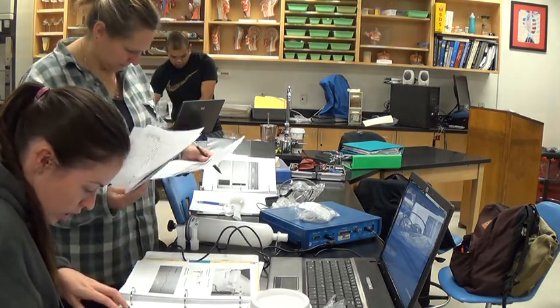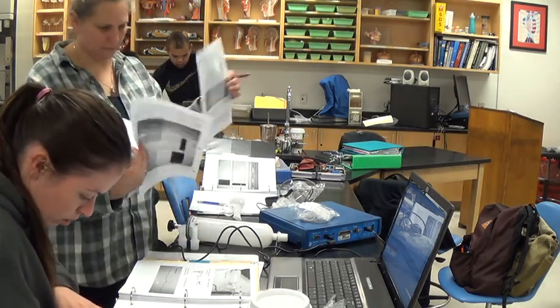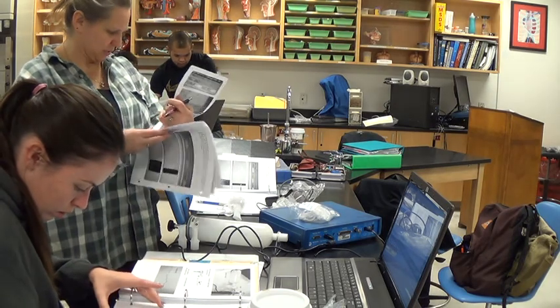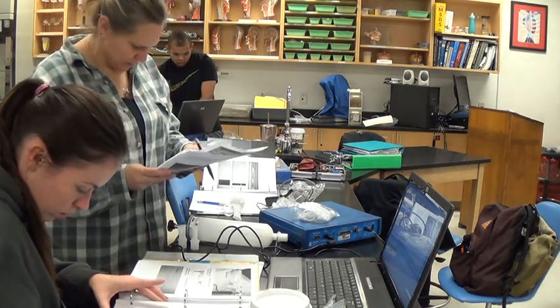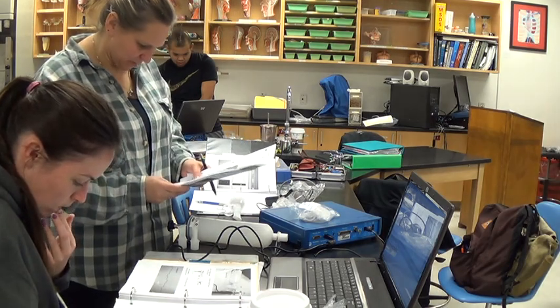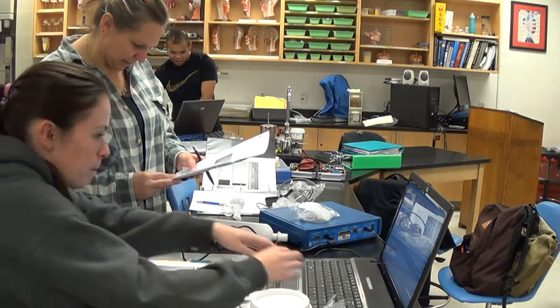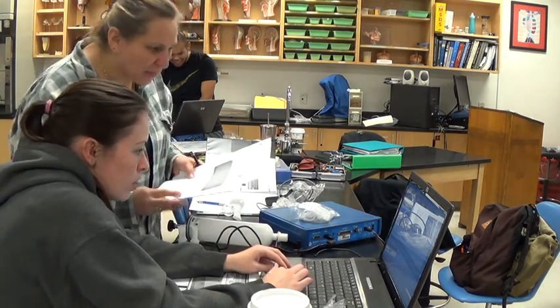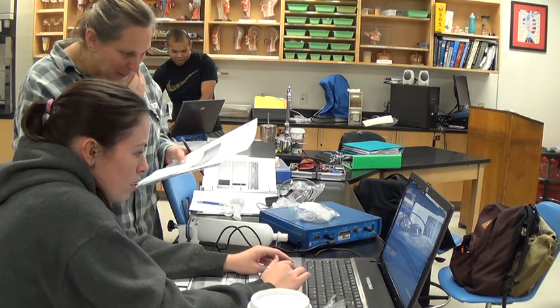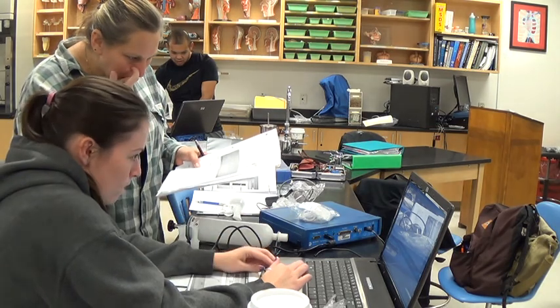Highlight the inhalation of the third breath, normal breathing. This one's 3.72. This is going to be a really low FEV1. It's going to be like 25%. Oh, is that bad? It's pretty low. 370. Normal should be 80. Sorry, guys.